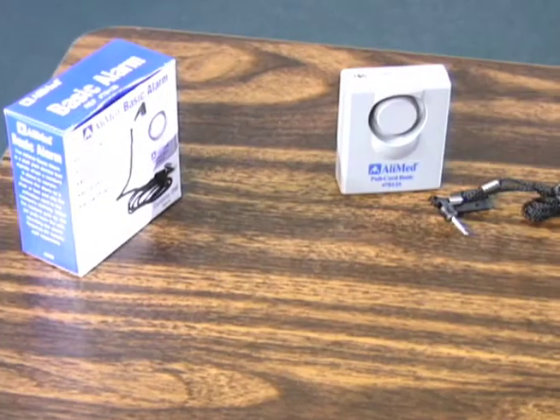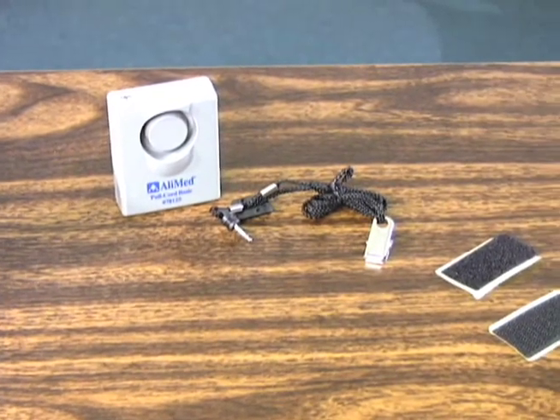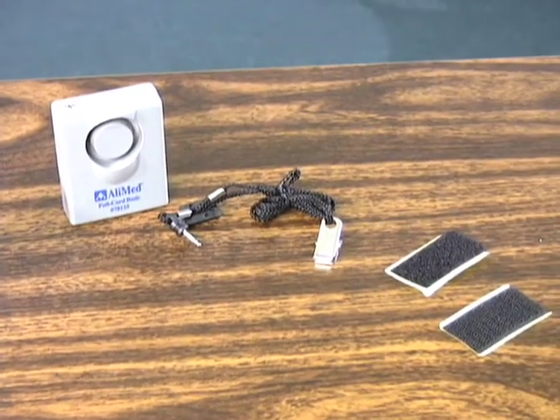The pull cord basic alarm includes the alarm unit, an 18 to 36 inch adjustable pull cord, and a hook and loop adhesive backed mounting strip. This alarm is ready to use right out of the box. Just add batteries and you're ready to go. The device uses one 9 volt battery for operation.